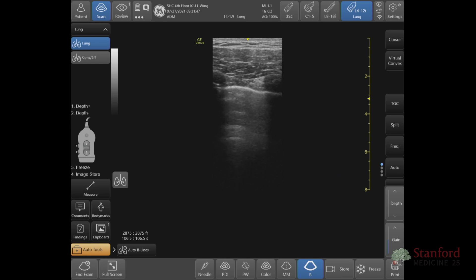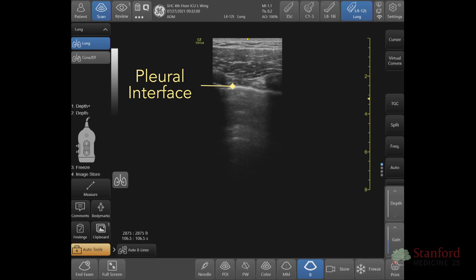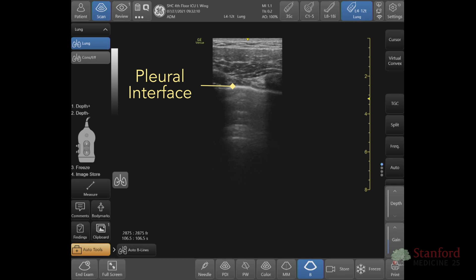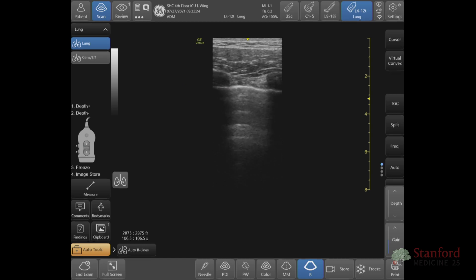I'm going to look for that bright white line — that's the interface between the visceral and parietal pleura. If I see movement along that bright white line, I sometimes call it 'ants on a log': you see these little things moving back and forth as your patient breathes. That movement lets you know there's no pneumothorax. If there is a pneumothorax, air comes in between the visceral and parietal pleura and you won't see that movement any longer. As long as I see movement, as I do today, I can feel confident my patient doesn't have a pneumothorax.